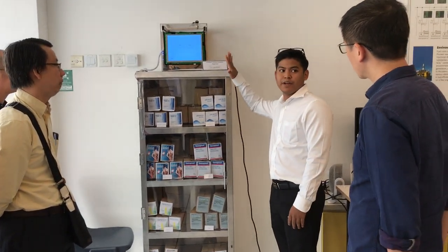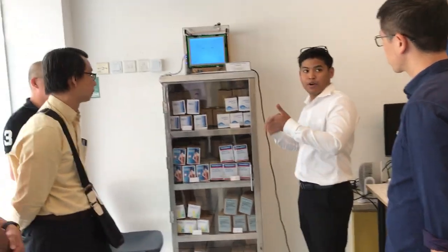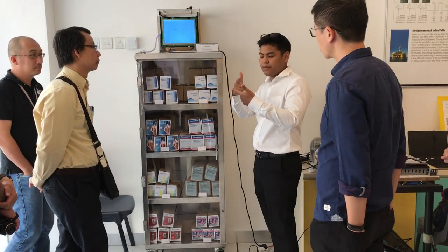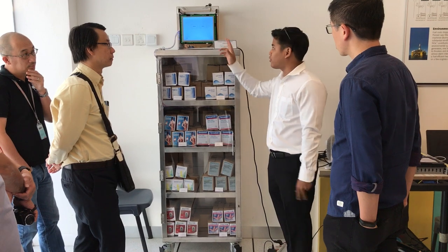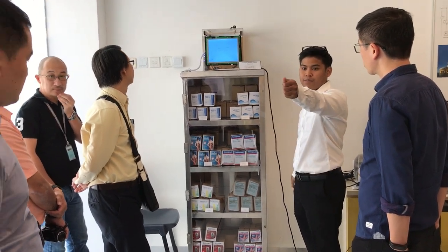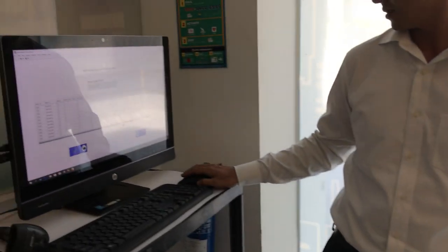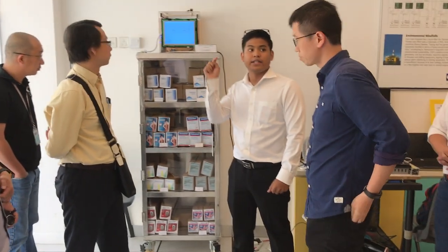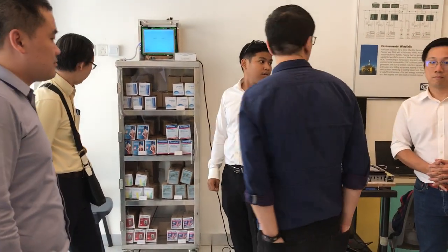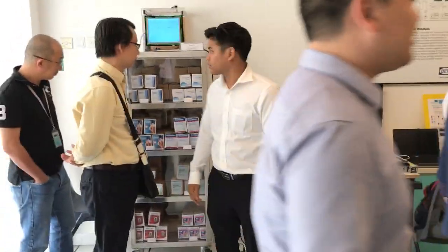Where is the database stored? It's in the computer. For every transaction — when you stock up or retrieve — it will send the product ID of the staff that accessed the system, the stock up or retrieve data, all the product quantities, and the product IDs. The MIRIUM just receives all that information and sends it to the computer. The computer stores everything.